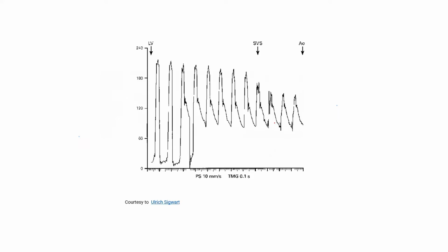LV-aortic, there is systolic... this is a pullback catheter from the LV to the aorta, and there is a systolic gradient in the aorta. Yes, very good. So this is what, aorto-aortic gradient. The gradient is between the aorta and the aorta, the proximal aorta and a distal part of the aorta. Because here, all through the LV, there was no problem.